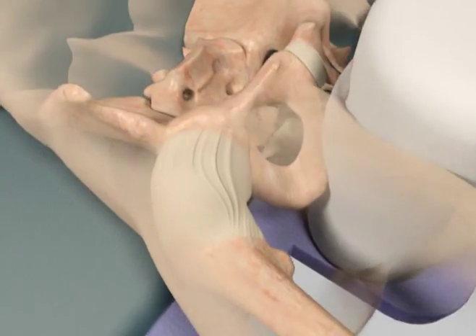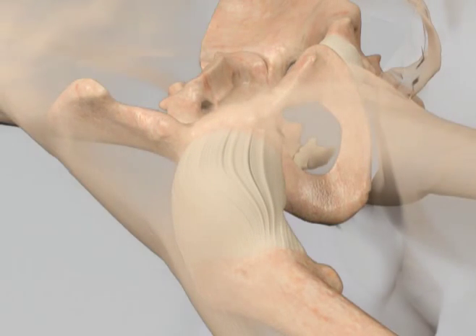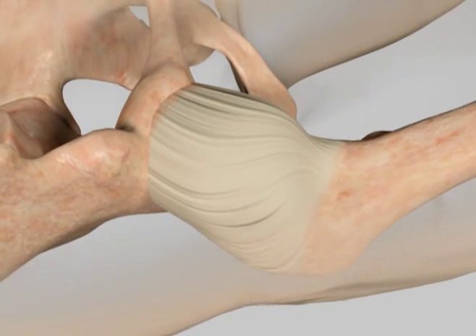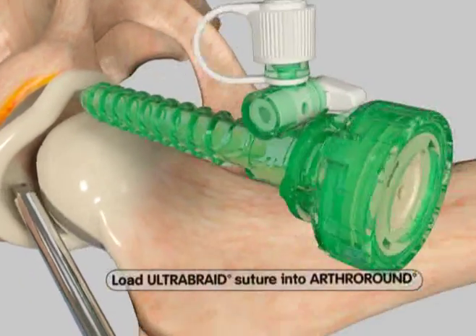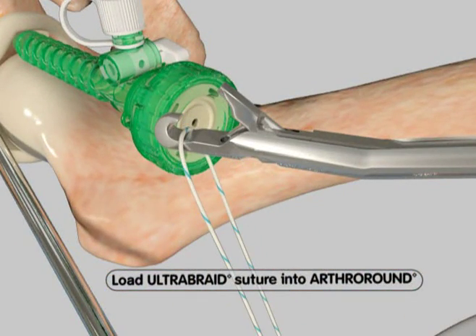The procedure steps are shown through the mid-anterior portal. Although the procedure can be performed percutaneously, it is shown here being performed through a clear-track disposable cannula. The internal view shows a labral tear located at the 3 o'clock position, with the soft tissue and bone already prepped for repair. The first step is to pass the ultra-braid suture with our arthro-round suture passing device.